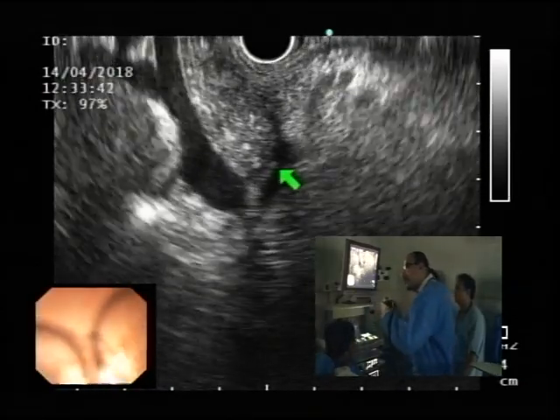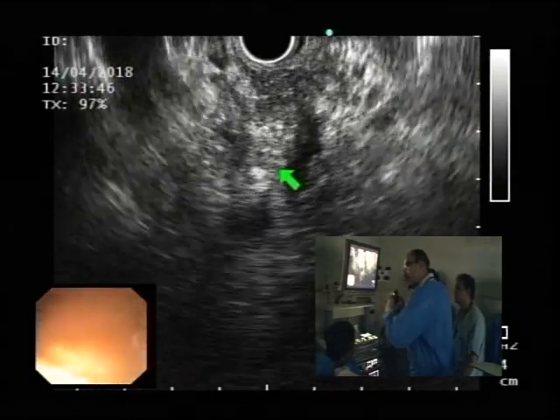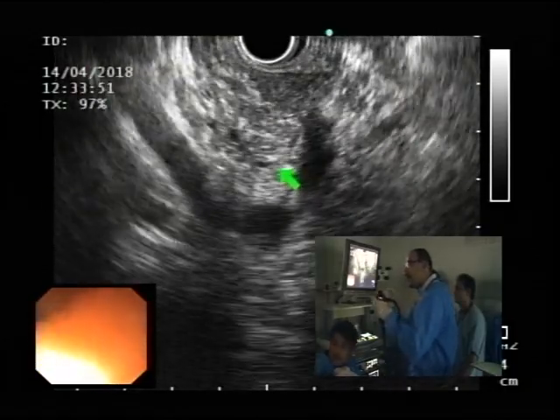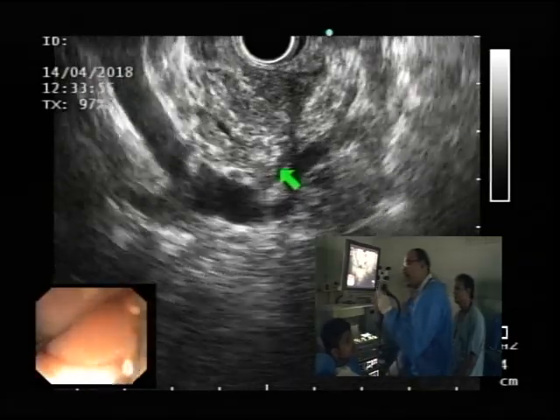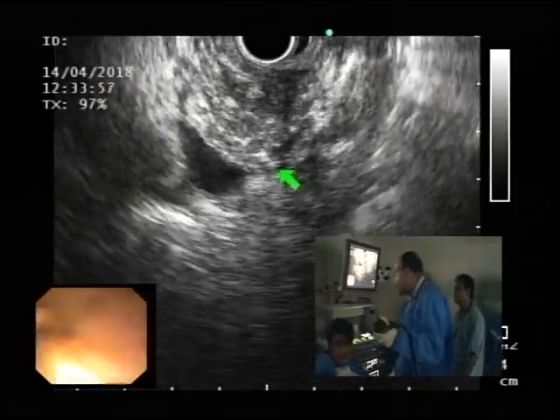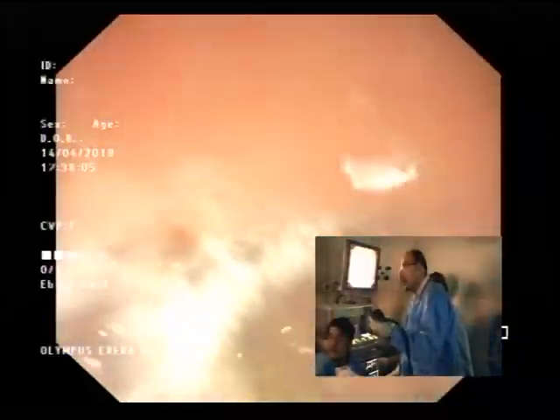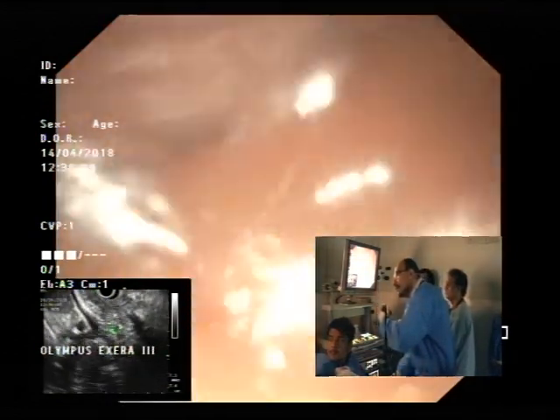Again, he's slim, and we have to be careful not to do anything too harsh in terms of our movements. There are many things involved here. I do use small wheel to the right. I put up the balloon, advance gently. We'll enlarge the screen a bit. Yes. Just to get my bearings as to where the second portion is.